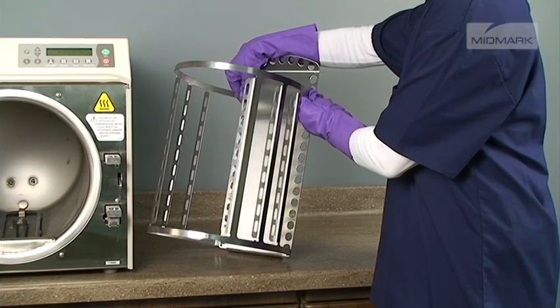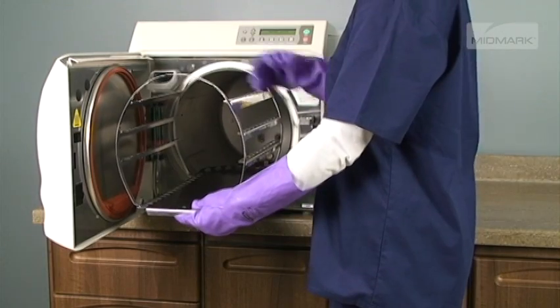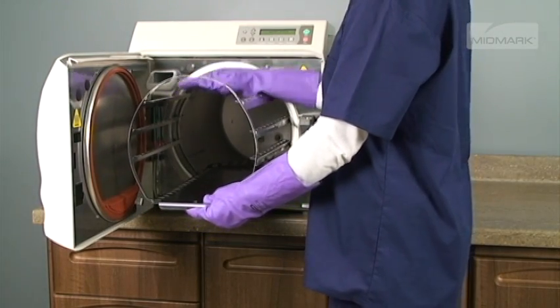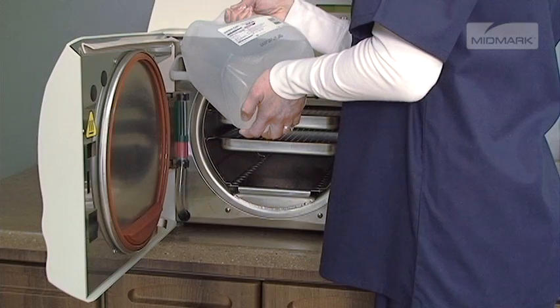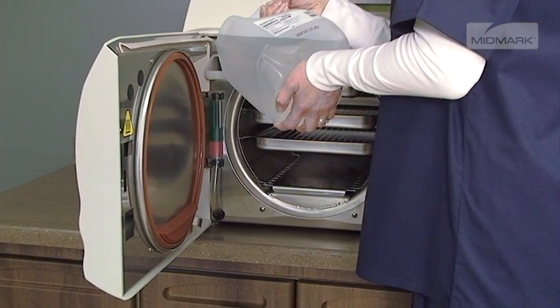To install the tray rack and plate back in the unit, insert the tray rack into the tray plate. Press down on the tray rack while sliding it into the chamber.